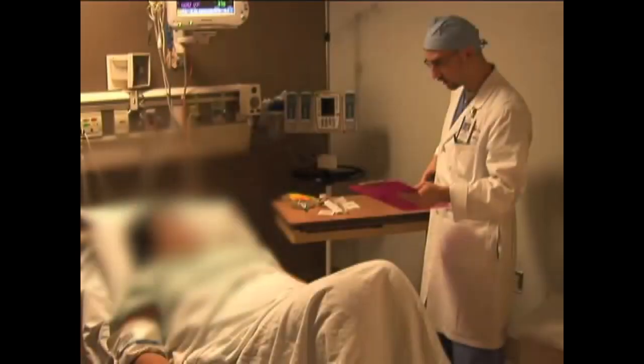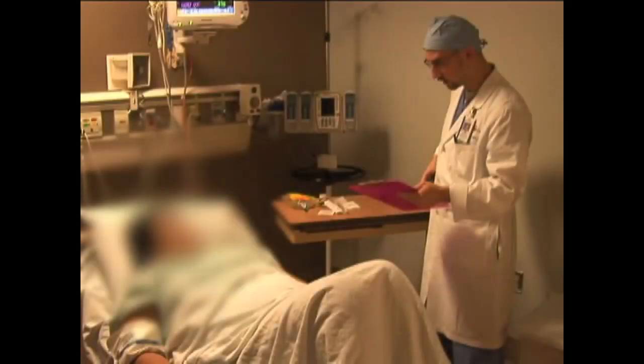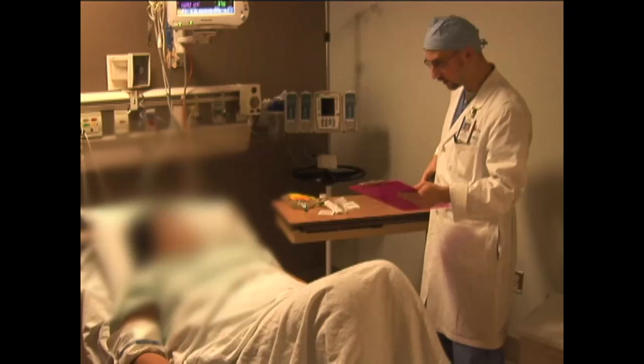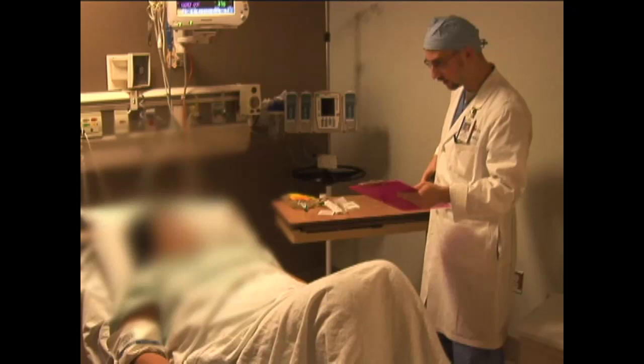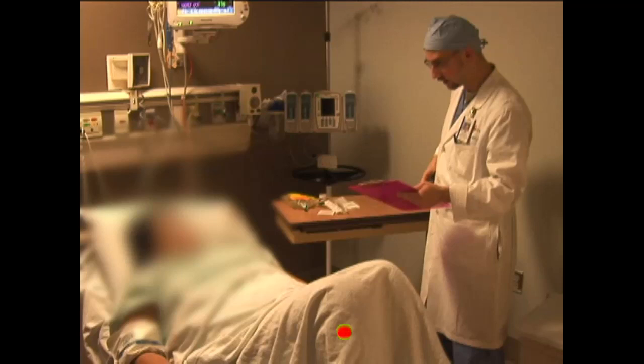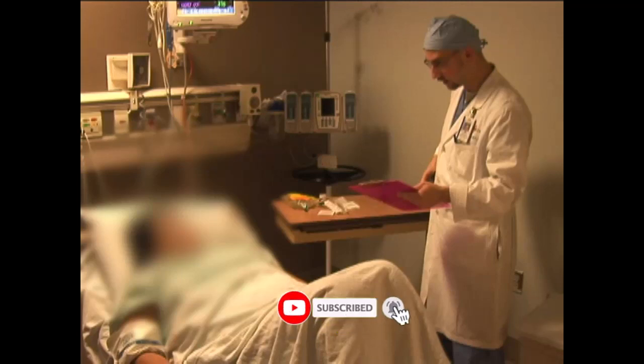This patient is a 22-year-old female with a history of hypertrophic cardiomyopathy, sinus bradycardia, and ventricular fibrillation. Her previously placed dual-chamber implantable cardioverter defibrillator was at elective replacement indicator, and an ICD generator change was performed.